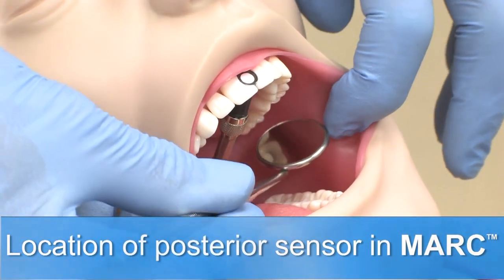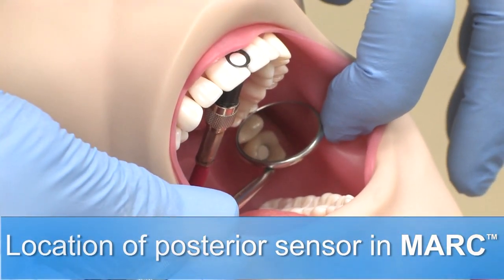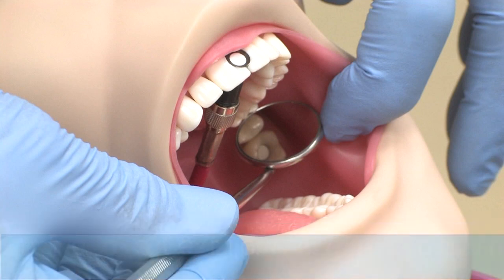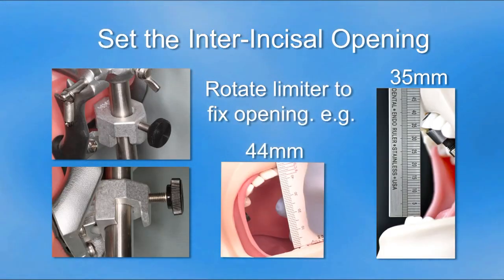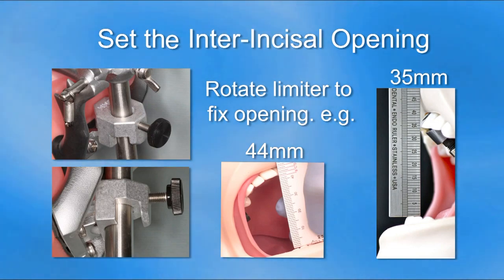Here we can see the location of the posterior sensor in the upper left second molar. This sensor represents a more difficult to cure restoration and is 4 millimeters deep from the cusp tip. The interincisal opening can be adjusted and fixed using the limiter at the back of the typodont. The smaller the opening, the more difficult it will be to reach the posterior restoration and sensor.